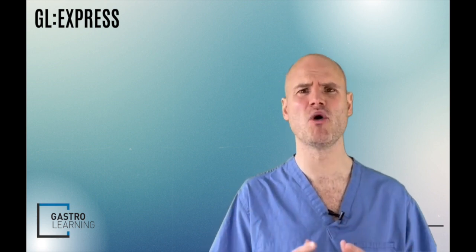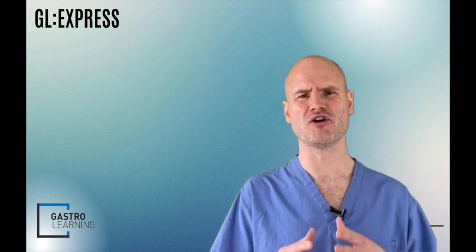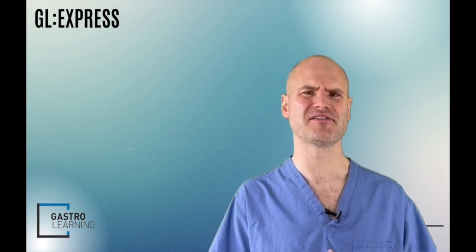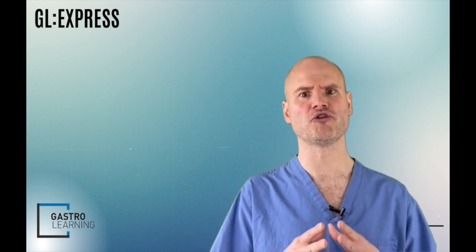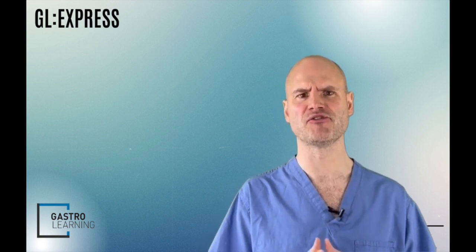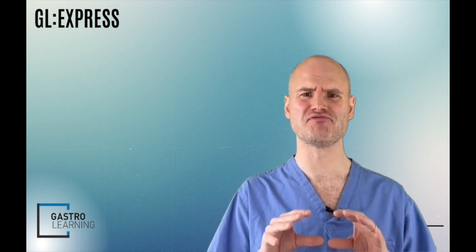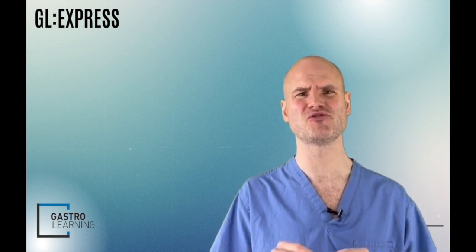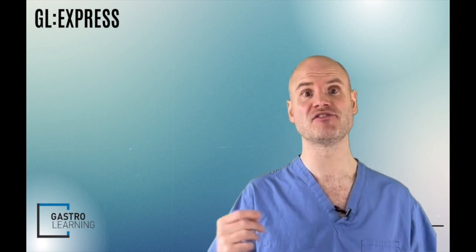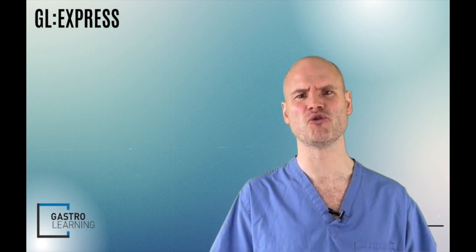So there's clearly more work that needs to be done, particularly prospective studies looking at these intraductal fully covered metal stents versus the plastic stents. And we also know that you probably need to look at longer treatment durations of over 6 months to properly compare this work. However, certainly this study demonstrates promising data that intraductal metal stents may well be effective in stricture resolution, preventing recurrences, and of course reducing that impact on both patients and healthcare resources.